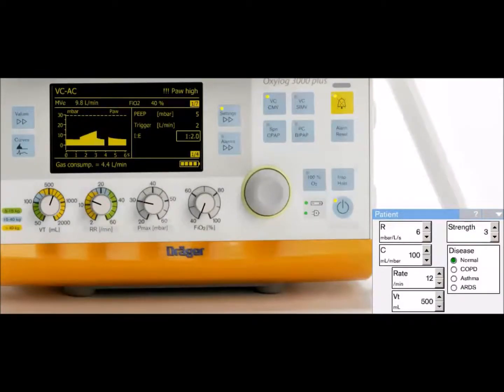I would just like to contribute my thoughts on patient comfort also. This is not associated with the paper at all. It's through my own work. When I think of using a mode of ventilation in patient comfort, I think about how many asynchronies are associated with a certain mode of ventilation. Is volume control CMV with dual targeting more synchronous than, say, volume control CMV with set point? One thing that's not pointed out in the paper is that this Pmax setting or the pressure limiting allows for better synchrony with cycling, and I'm going to get more into that.